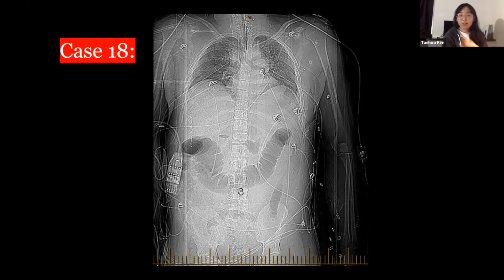So by the book, you don't need CT to diagnose pancreatitis, except when you're also trying to look for other etiologies, or if you think the patient is presenting late, like a homeless guy who drinks a lot and has had this pain for many weeks. That's when you could ask for a pancreas protocol.